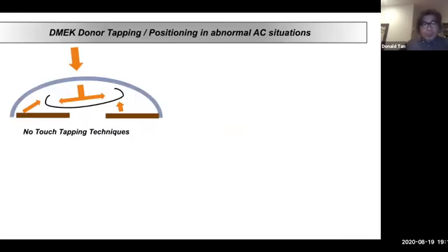So with this standard tapping technique, the no-touch tapping technique, certainly it is the standard today. And what we're doing is, of course, we're applying indirect pressure through the surface of the cornea, and that creates fluid waves to unscroll this tissue. Now, it's really important then, if you see this, that what we're really doing here is that we are trying to use the chamber itself to have these fluid waves. So we need to have fluid coming back, transmitted to the donor from the back of the cornea, but also the sides and the iris. So this whole closed chamber concept is very important to allow us to tap.